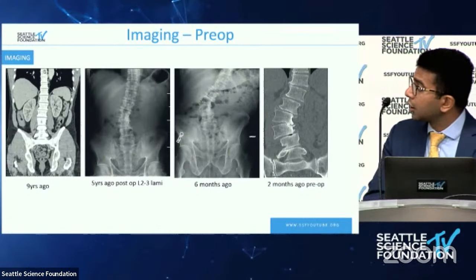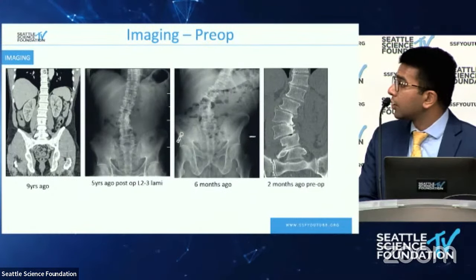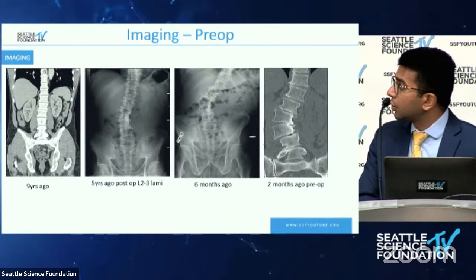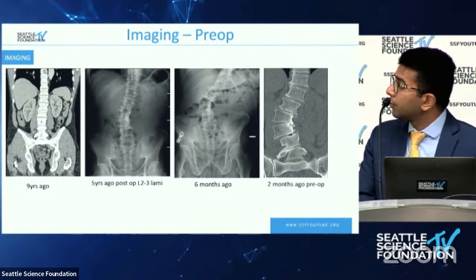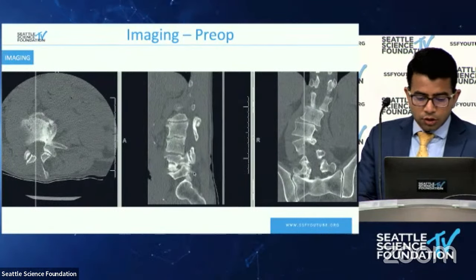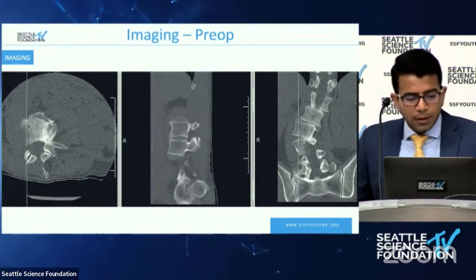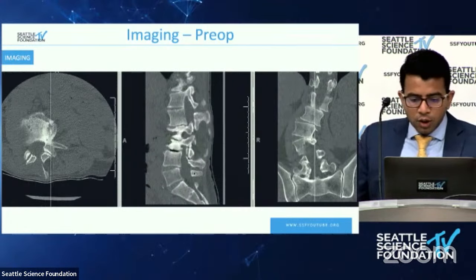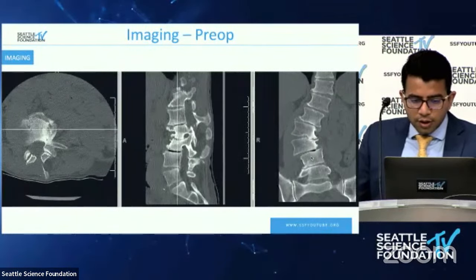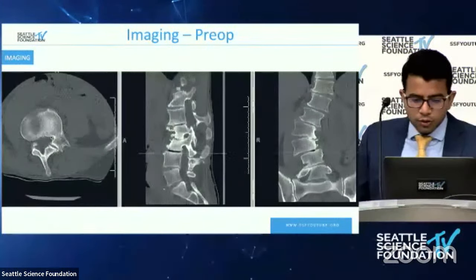At that time, we also counseled him about scoliosis repair or reconstruction and long segment fusion, et cetera. Then we got a pre-op CT where you could see L2-3 and 3-4 vacuum disc and a significant curve in his scoliosis. These are his pre-op CT images, shown through sagittal and coronal images. The L2-3 pars is intact, but the lower level is digging into it a little bit, and that's causing his scoliosis.